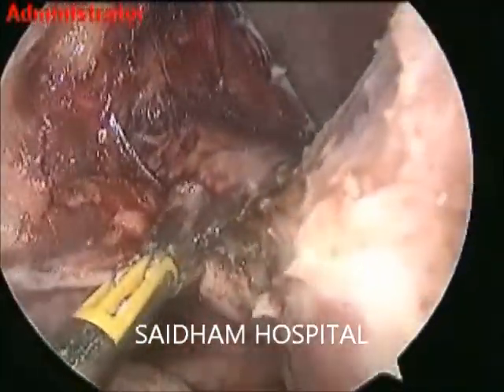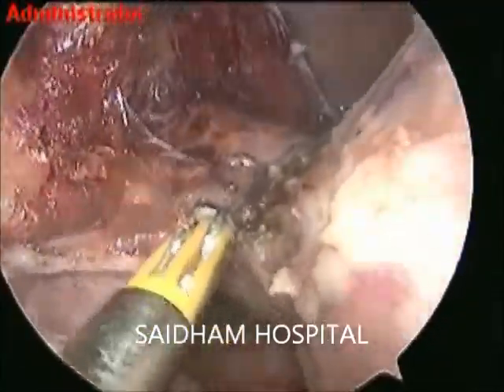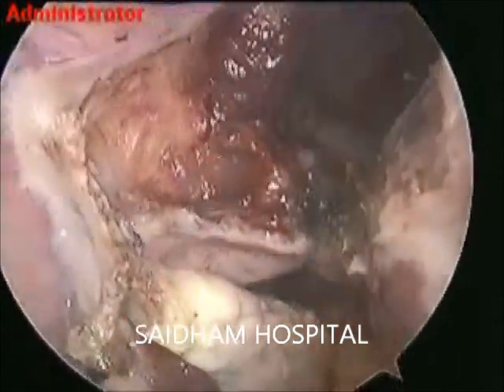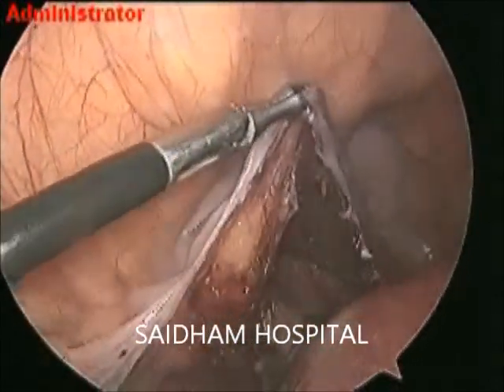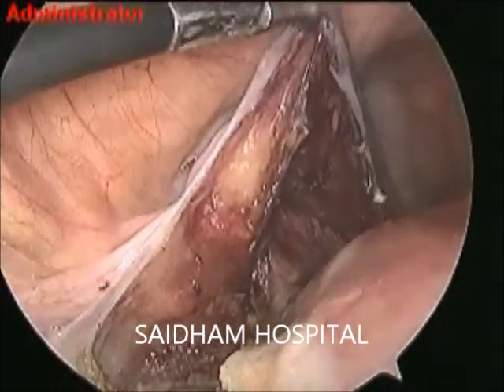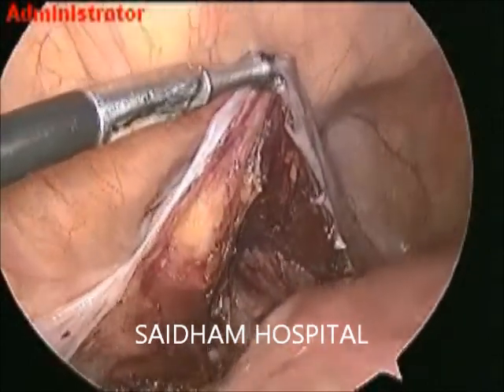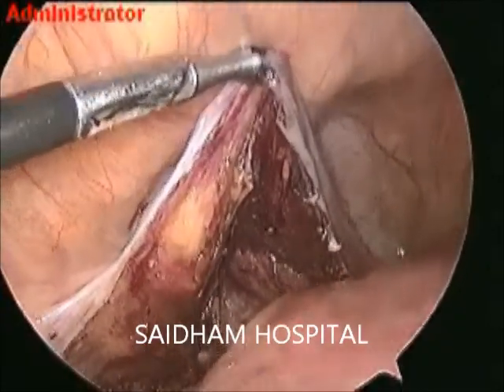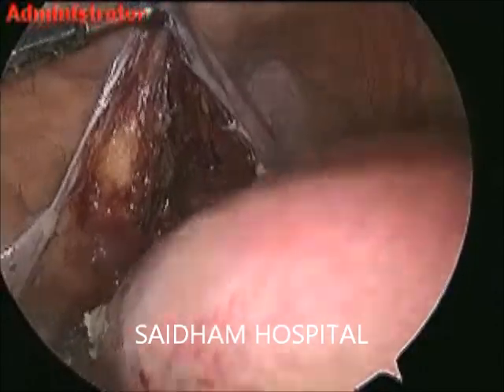Using bipolar for uterine vessel coagulation is a very important habit — achieving full coagulation and hemostasis. Full coagulation until the bubbles subside and the machine sounds. Over-coagulation is allowed here so that the uterine artery can be thoroughly coagulated and cutting will be easier.